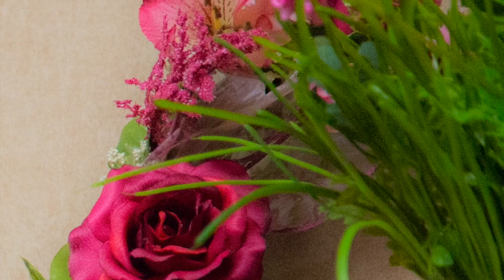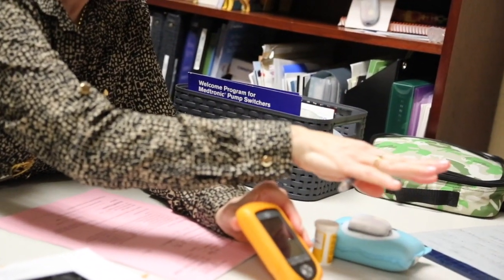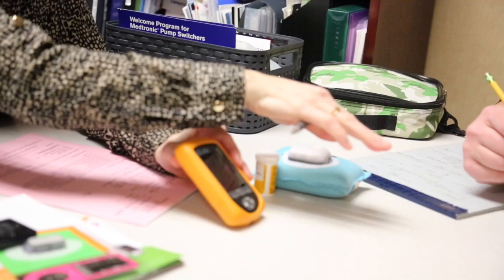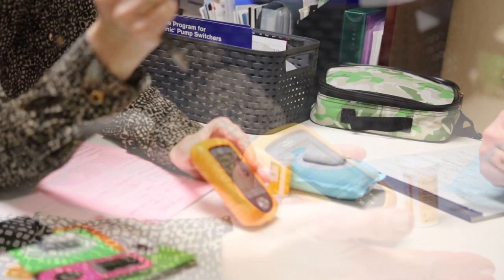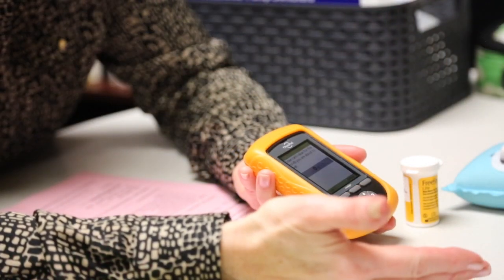With the pump, it's going to be the same. You're going to push your buttons on here. It's going to remotely tell your pod, and your pod then over a minute's time will give you that entire dose. It doesn't stay in the pod. It's in your body. But it doesn't work. Boom. It's 15 minutes still.